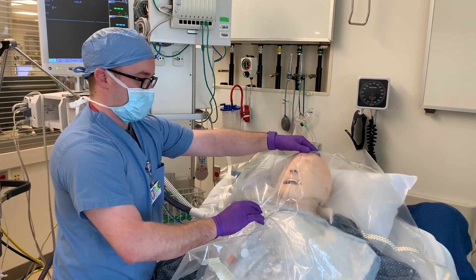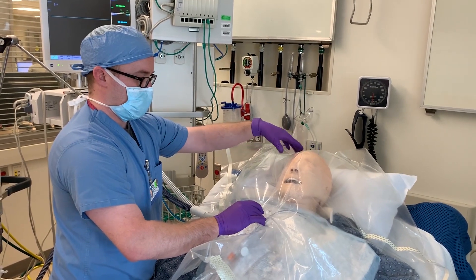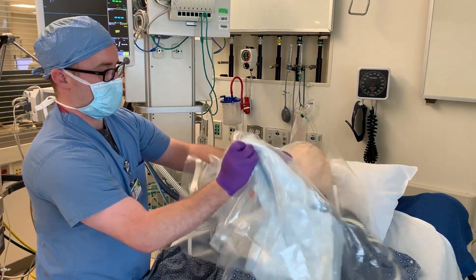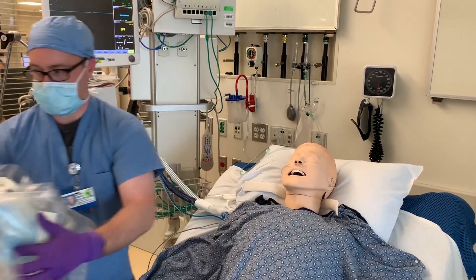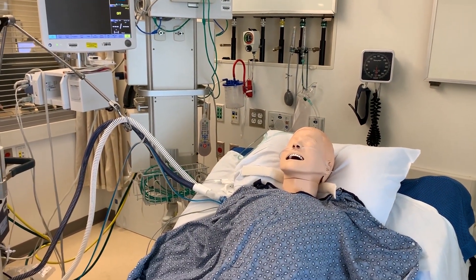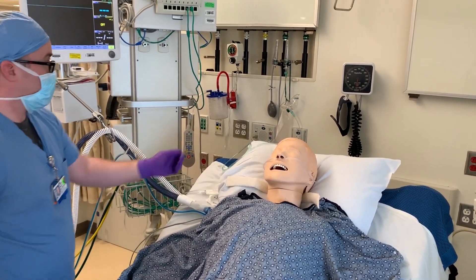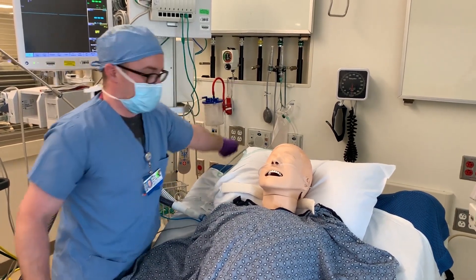Once you've ensured that the patient is no longer coughing, you may pull away the drape and the chuck together, keeping the contaminated side in, and dispose of this in the trash. You will then turn on the auxiliary oxygen for the nasal cannula.